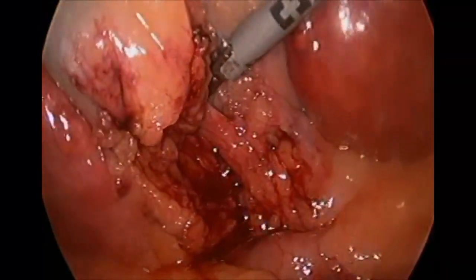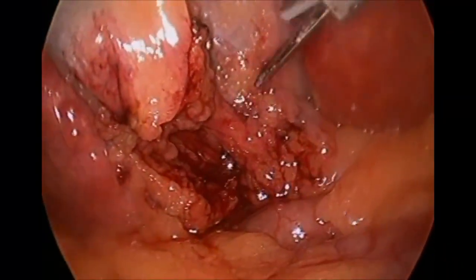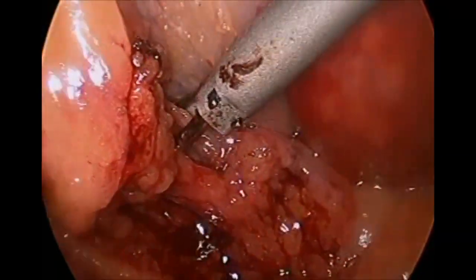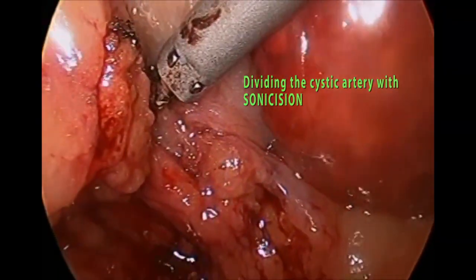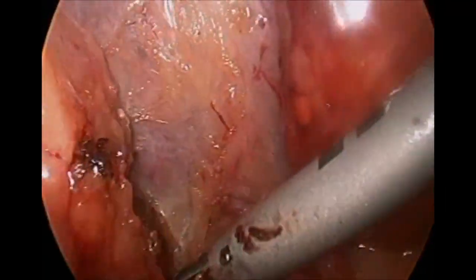Now we're going to open the peritoneum over the cystic artery. Then we will divide the cystic artery using the Sonicision ultrasonic dissecting device.